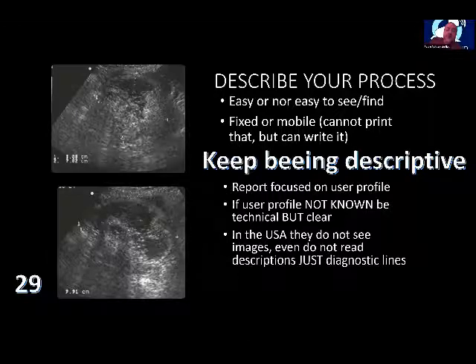When you report the image or let the referring physician know what you're looking at, try to describe what happened during the procedure. If you have had a hard time trying to figure out what happens, and you're the expert on image, or you are performing the examination for a good reason, you know how to do it, or you're training to know better how to do it, it's not bad to describe what happened during the examination.